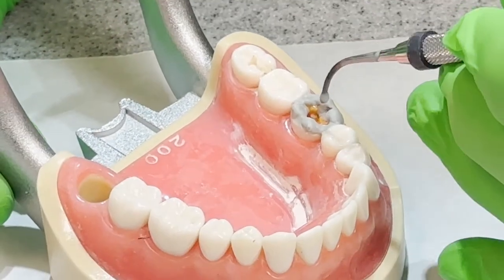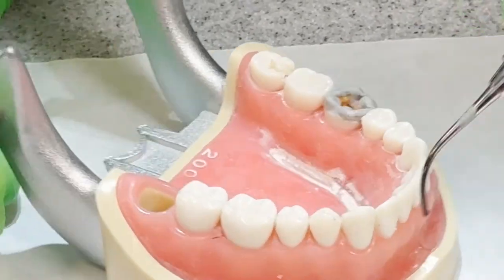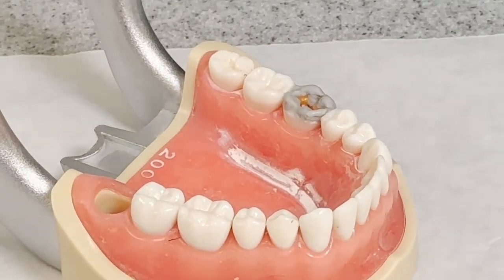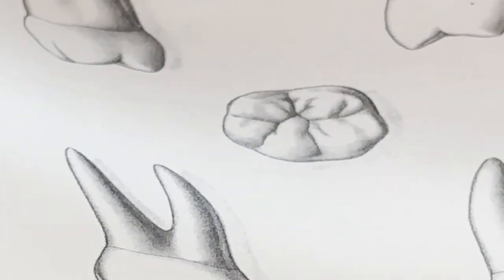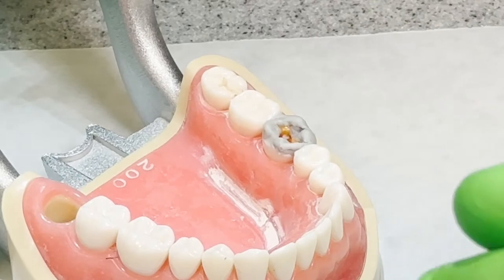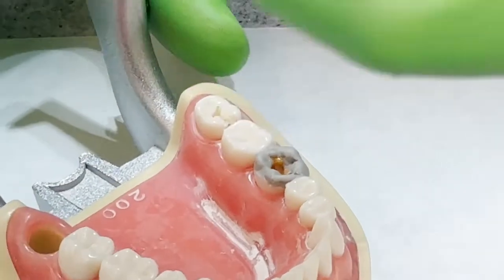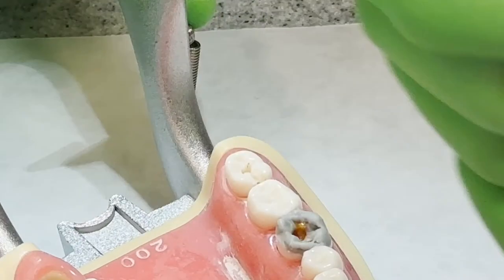Everybody see that okay? It would be a good idea to have this sheet on hand with the occlusal portion of the crown, so you can keep an eye on that and get the idea of the anatomy again. As you feel this, you want to make sure there's no voids. You just melt it into the existing wax.